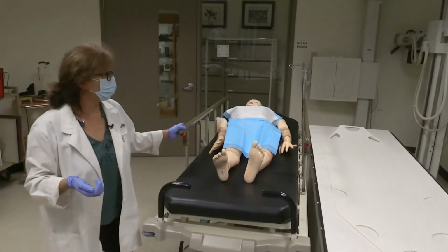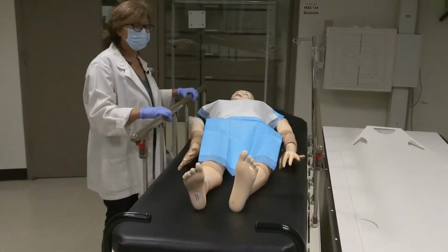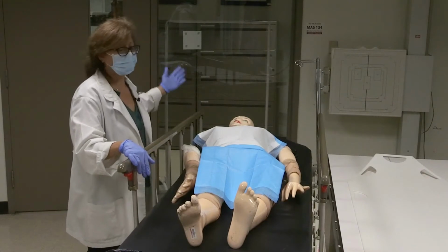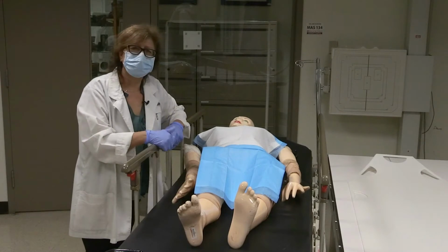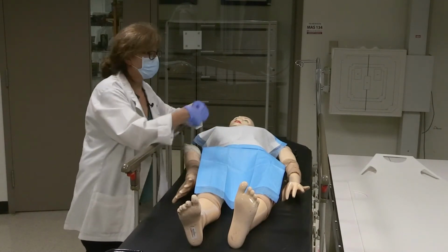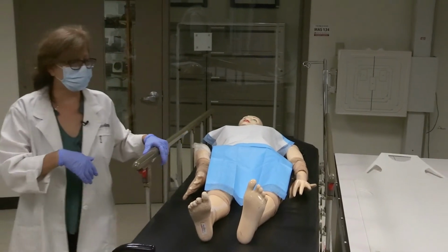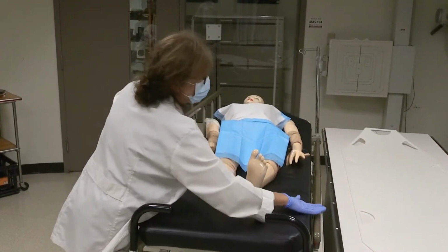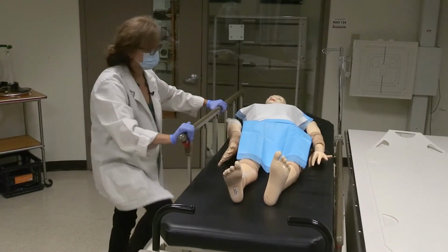Okay, the next thing I would do is, depending on the patient's ability to move, I will ask for assistance from my teammates. Now let's say a patient really doesn't want to get off the stretcher and walk over to the table, but they can slide over on their own. At this point, all I need to do is lower my side rail, ensure that I'm as close as possible to the bed, so I can adjust that right now.